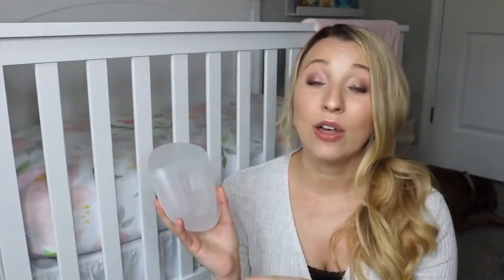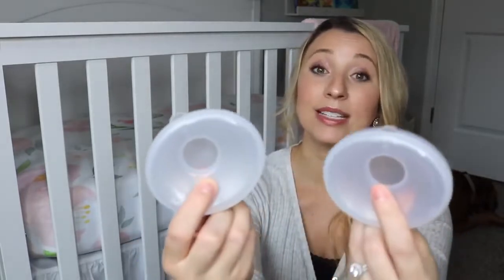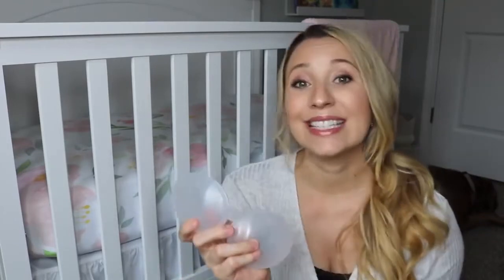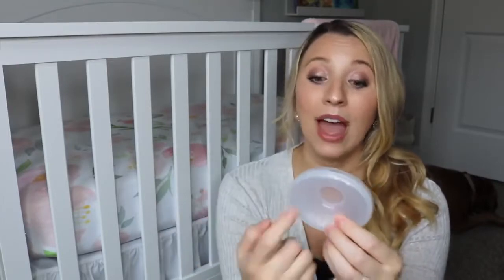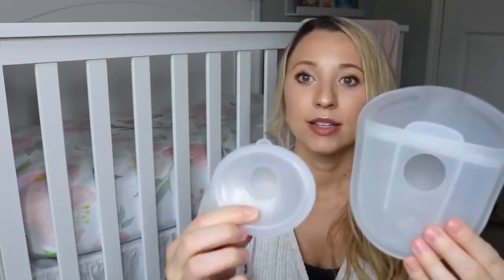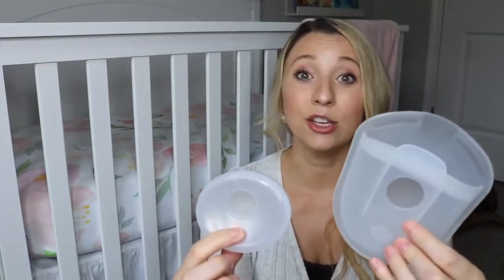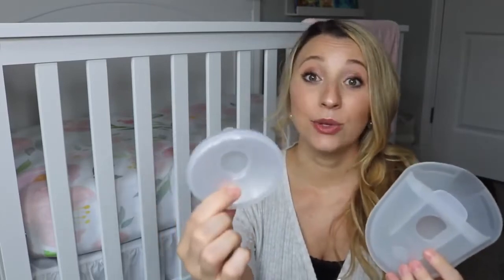The Milkies Milk Saver is from Fairhaven Health. I also wanted to show you guys these ones — these are the Milkies Milk Savers on the go. They are smaller and this is what you can use instead of nursing pads. Again, it will catch any milk. These fill up really quickly for me, so in comparison, you can see that this one is a lot larger. This is the one I use during my feedings with Eliana. These smaller ones I use on the go.